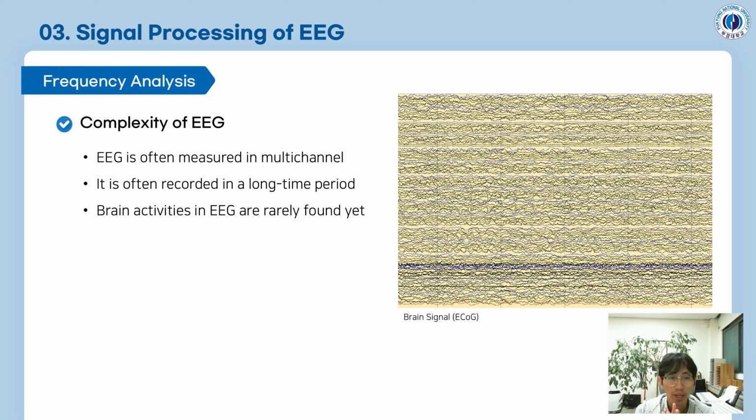For example, if you have some problem of epilepsy, then you go to hospital and you are going to record your brain activities for a very long time, maybe 2 hours, maybe 3 hours, maybe it could be 24 hours. It's pretty long, and the size of the data is going to be very huge, and to analyze these signals is another job. So it's very, very difficult.